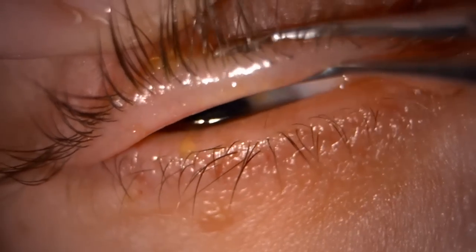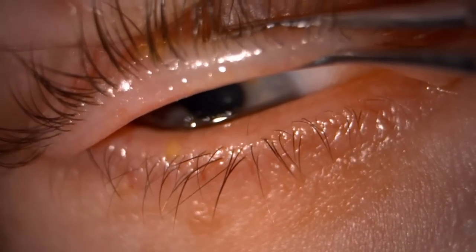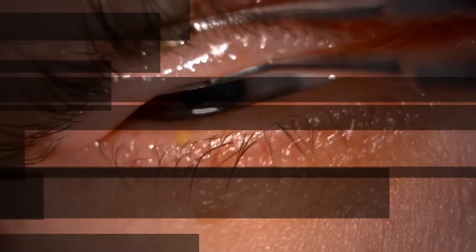The top lid usually doesn't tend to be as blocked as the bottom.